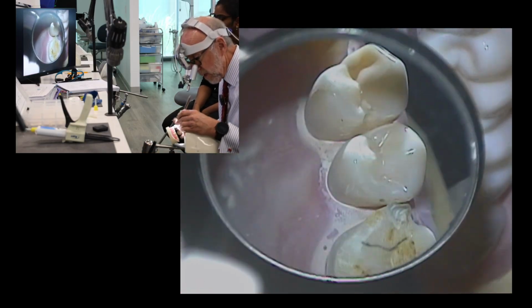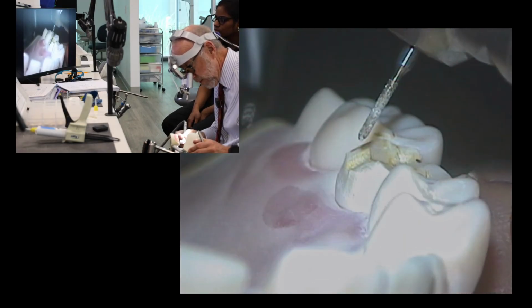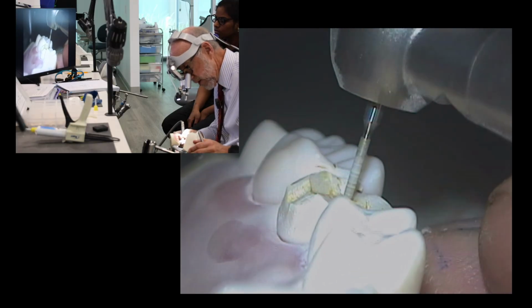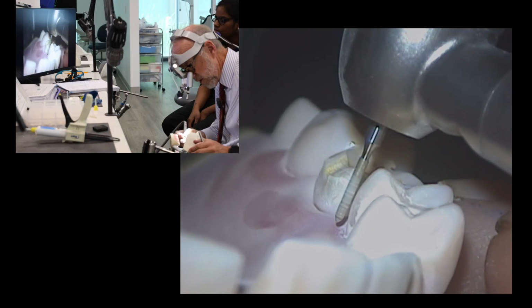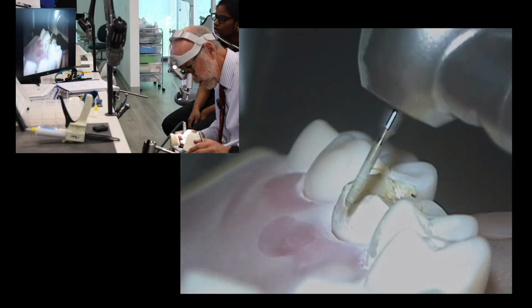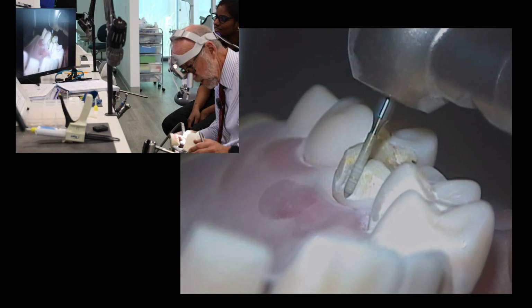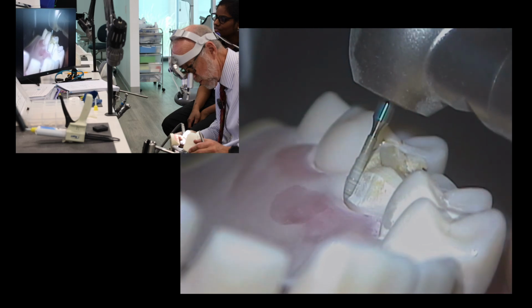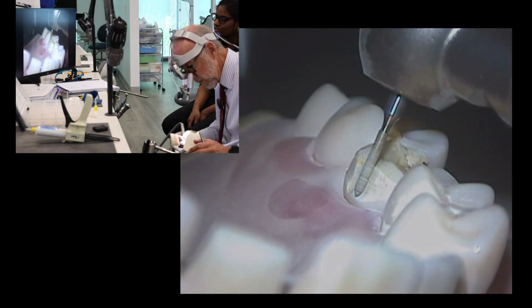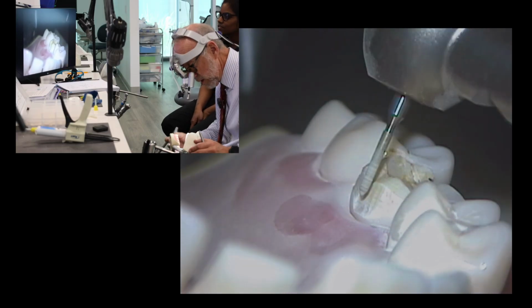Okay, so when we're doing the direct lingual, we can turn this way and use direct vision just like we did on the facial side. So here's the axis. Lean the burr a little bit toward the axis. We can take the taper from the middle third of the adjacent tooth, but not from the molar. Oh, okay. The molar is weird. Yes, on the Kilgore. So take this taper and reduce until you see the end of the burr, the margin, and get the margin a little deeper gingivally. So there's a nice chamfer, there's a nice taper.